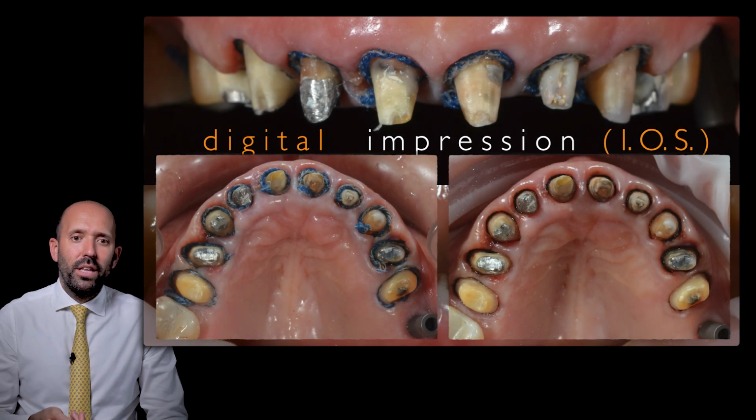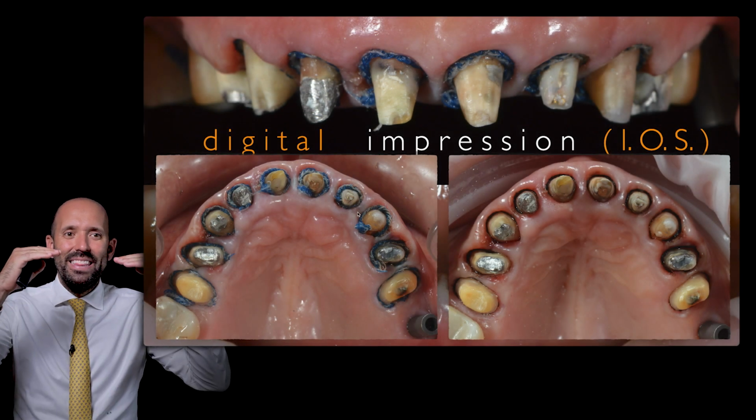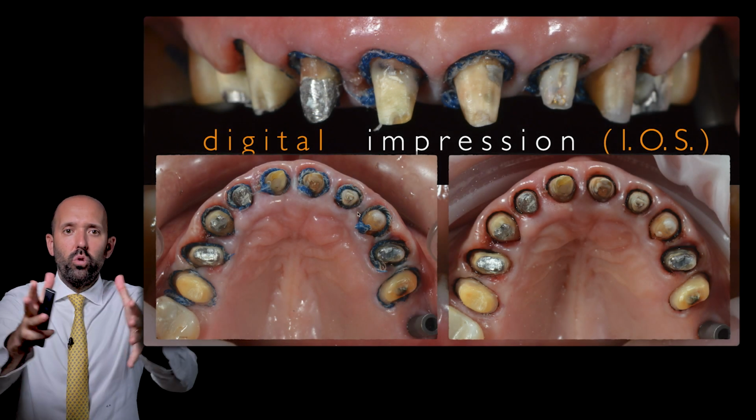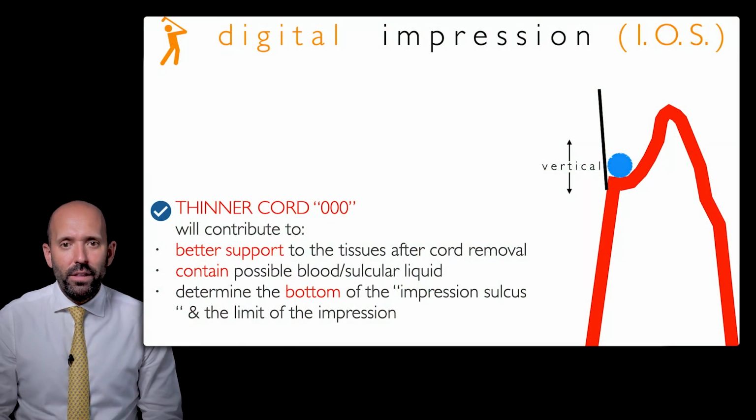Actually focusing more the attention on the maxillary arch, we have the first chord, 000 chord, in the bottom of the sulcus. Number 1 chord exactly at the level of the gingival margin to widen the sulcus. We do the exact same thing on the mandible.